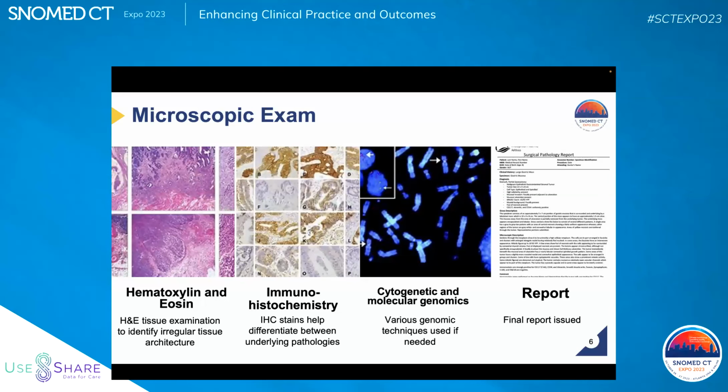All right. So those slides, the series of slides, are sent back to the pathologist for examination. Usually it takes 24 hours from surgery to slide prep and staining to get to the pathologist's desk to start their microscopic examination.